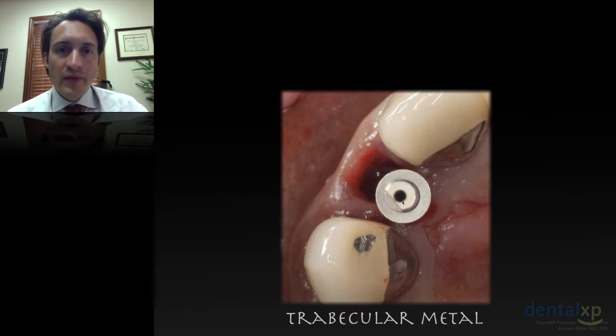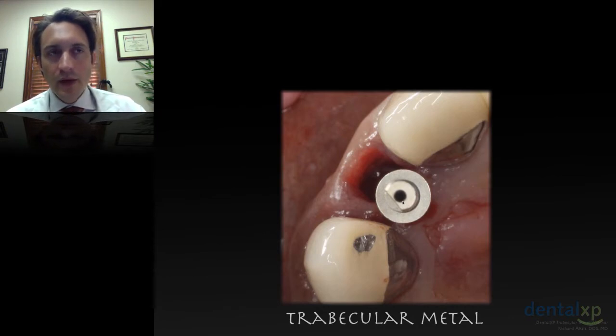And I'll harp on that because all of my provisionals are made screw retained. I feel that not only does implant placement to allow for screw retention make for an ideal final result, but it also forces me to have a nice buccal gap, which I can fill with bone to make sure that I have a nice buffer between the implant and the buccal.